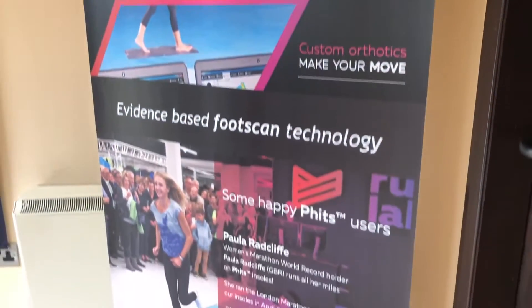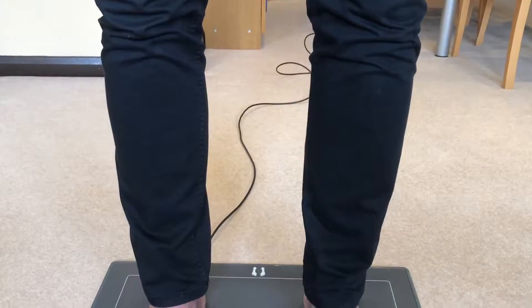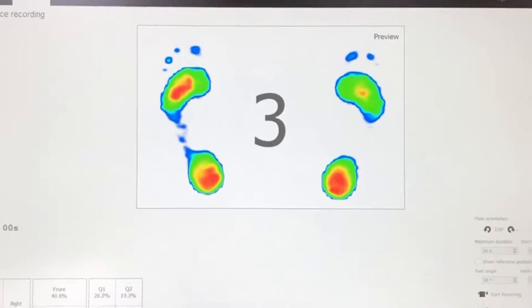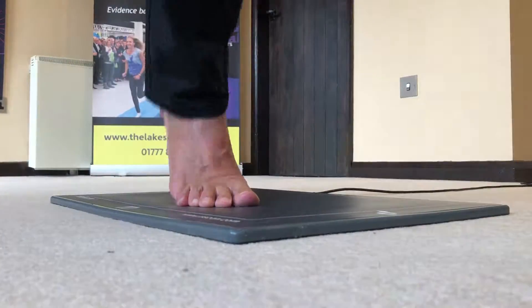Quite often the pain in the feet, knees, hips and back can be caused by biomechanical issues, and we can address those issues using this state-of-the-art scanning technology. I usually start with static and balance tests to assess your posture and stability, and then move on to the dynamic gait analysis.